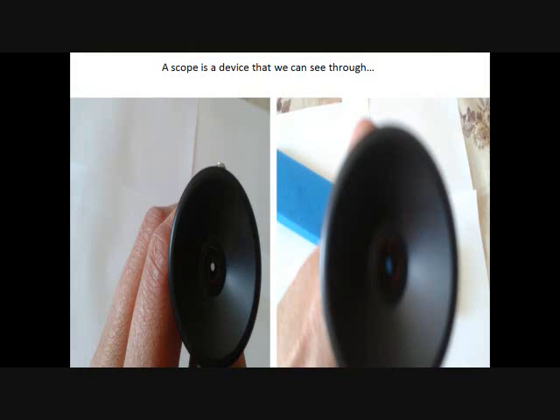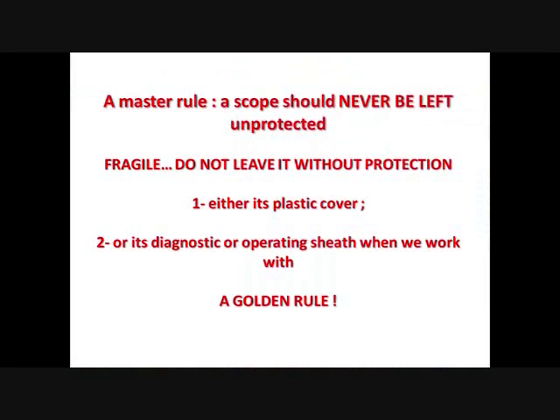And as we already said, a scope is a device that we can see through, like here. We see a white piece of paper on the left and a blue sponge on the right. Plus, we must always check the scope this way, by seeing through it. And we do this before leaving it to the room nurse or after taking it back to make sure that it isn't broken, like there is no scar, no fracture in the lens.